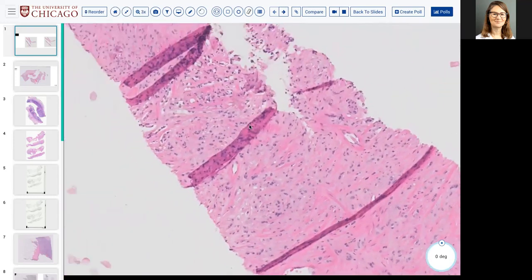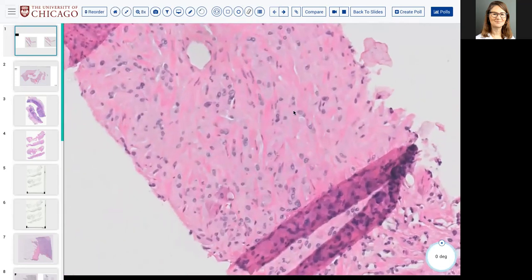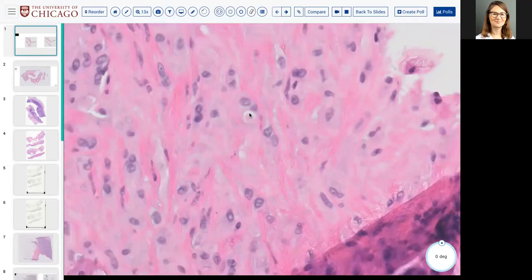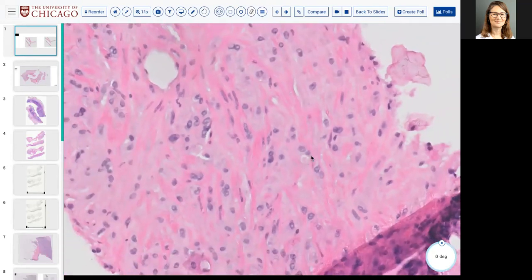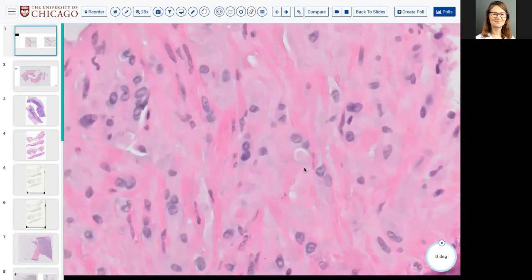Anytime you see a lesion that is trying to form some kind of structure, you have to think, okay, is this structure a duct? Is this a lumen? Is this a vessel? Things that form these little signet ring or duct-like structures, also start to think about pseudo endothelial spaces, because these cells in fact are trying to form lumina within their cytoplasm, and sometimes they even contain some kind of material or a red blood cell.